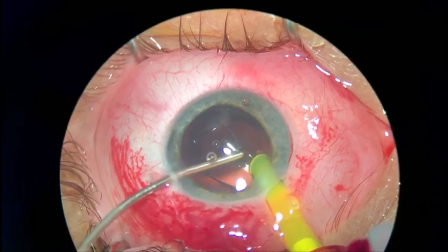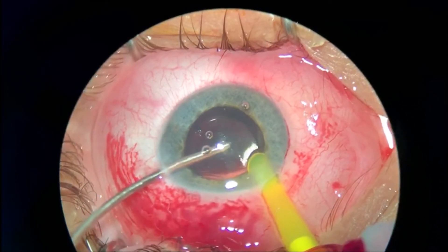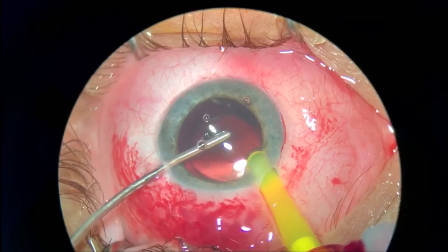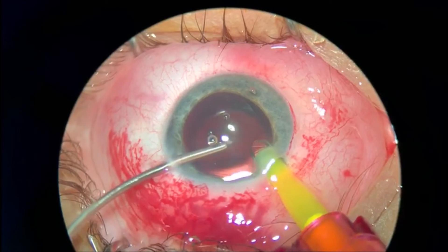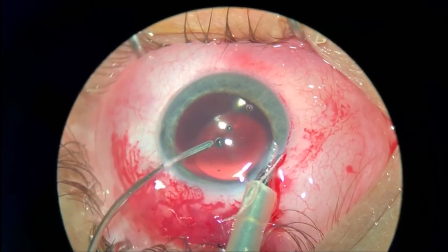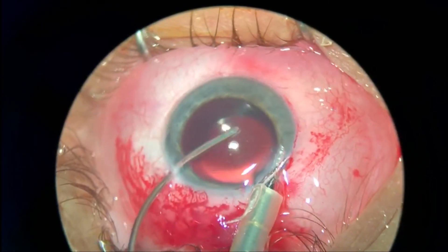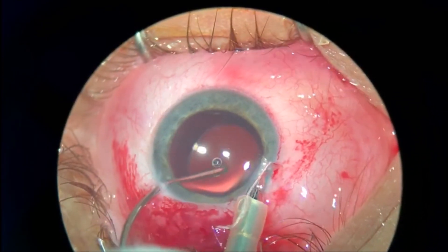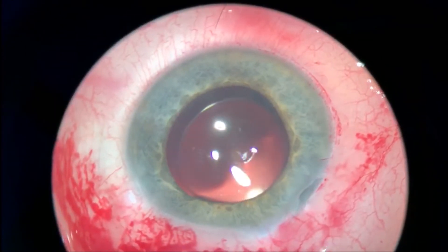I usually would not like to have just two incisions, so I am not going to do a separate side port. I use the maintainer placed into the main incision, and I think this covers the incision better than the irrigation port when removing the viscoelastic at the end of surgery.